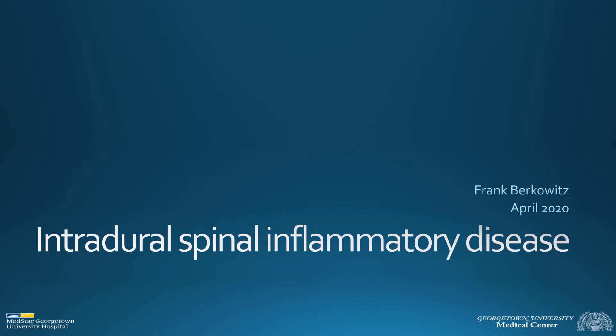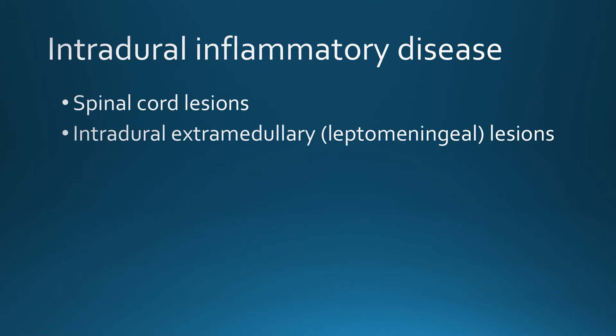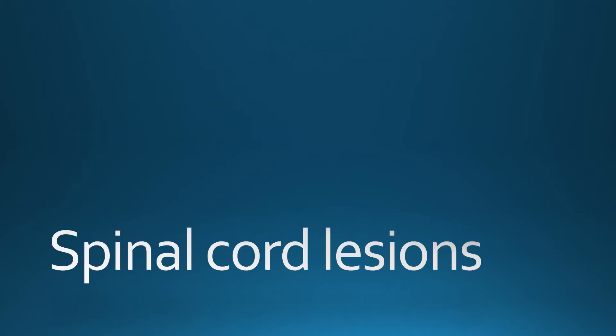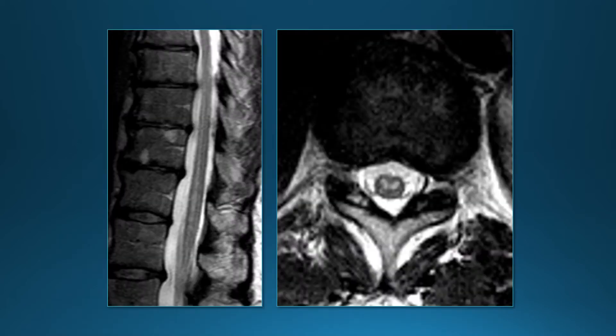This presentation covers intradural spinal inflammatory disease. We'll initially talk about spinal cord lesions — intramedullary lesions — and then intradural extramedullary or leptomeningeal lesions. First, for the spinal cord lesions, here are a few examples to review the spinal cord anatomy.